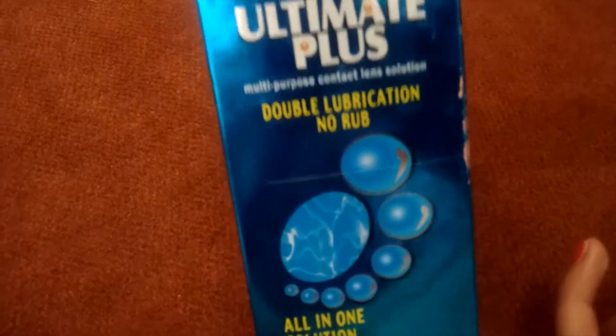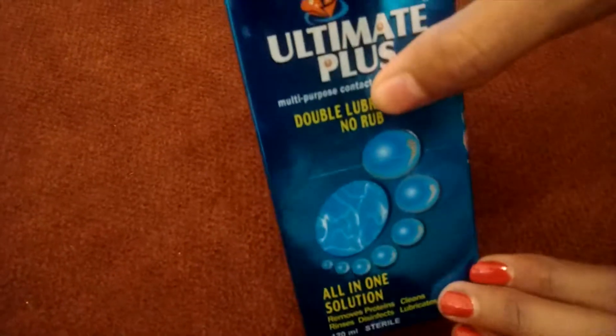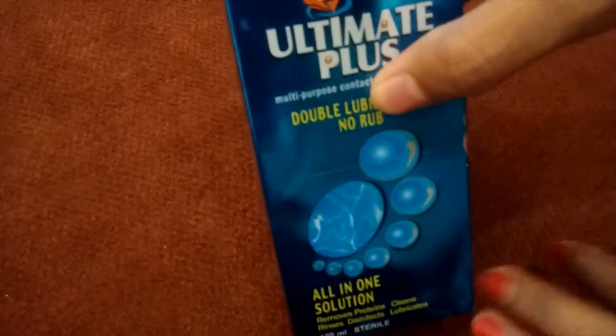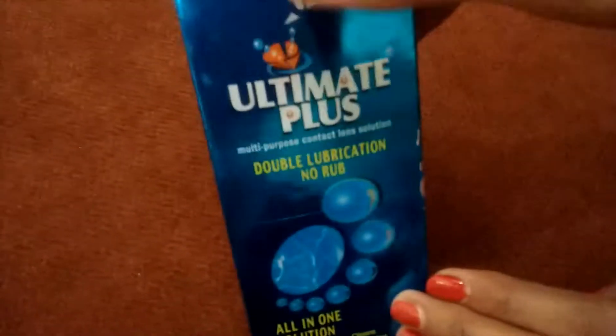It is a solution to soak your lenses in, and it will remove the protein aggregated on your lenses. It is also very healthy to store your lenses.